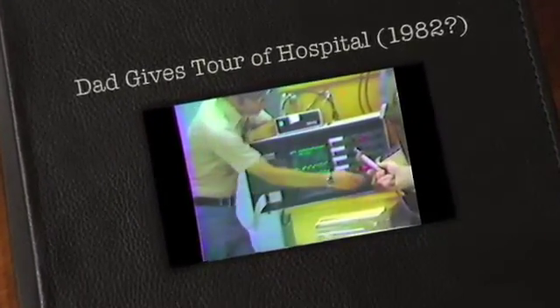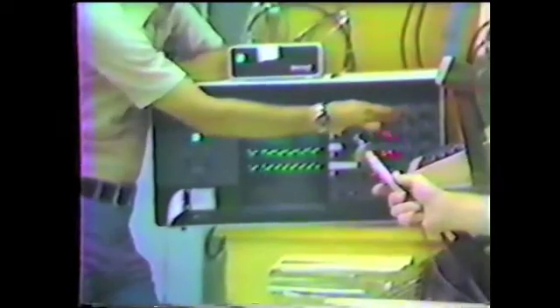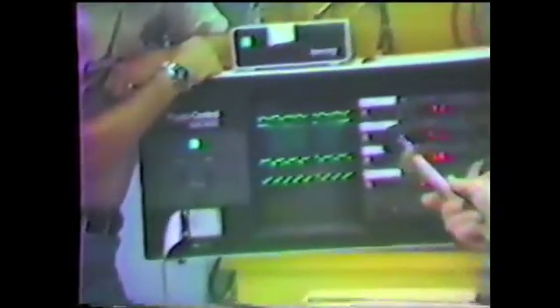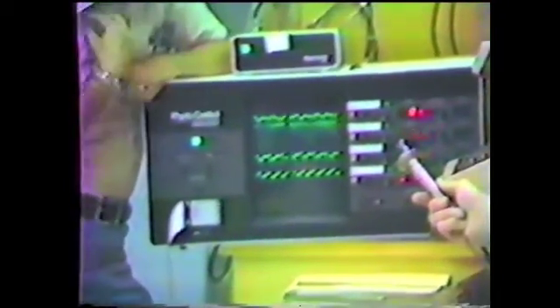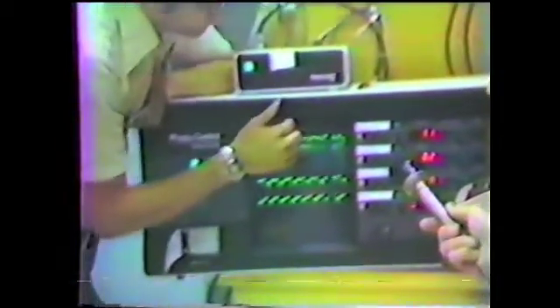What is happening here is that we have two patients that have set off an alarm. There are limits set here, usually for a heart rate between 50 and 150, which is a recognized normal or average to see. And what's happened here is a patient has probably become disconnected, either a wire, or maybe the pre-gelled electrode patch is loose or dry. The gel is not moist enough to make contact. So the alarms have sounded, and they'll go off again in a minute because the readings are lower than normal.